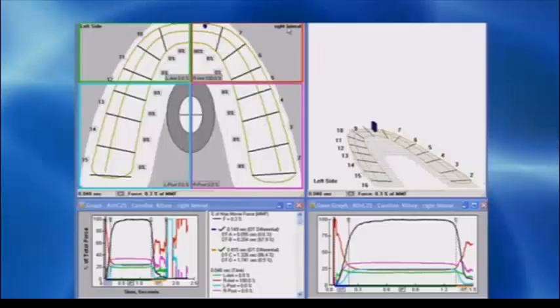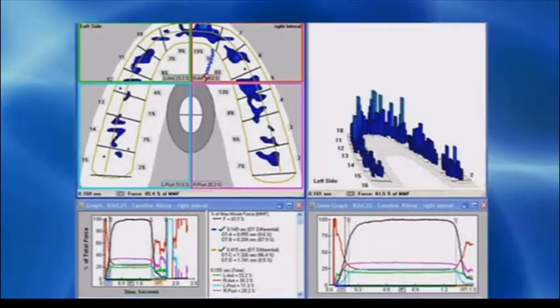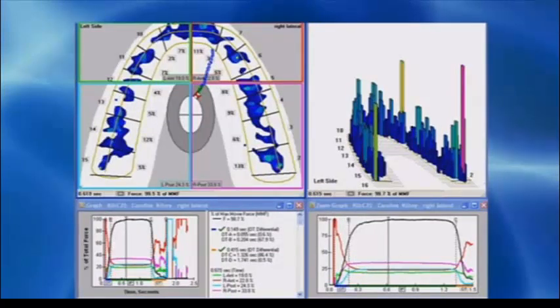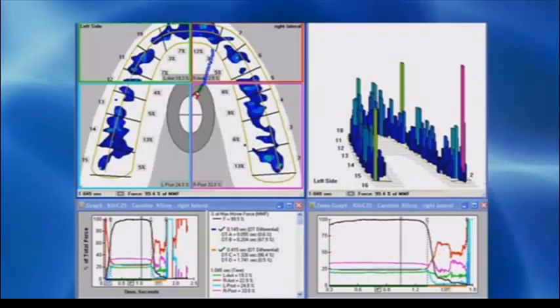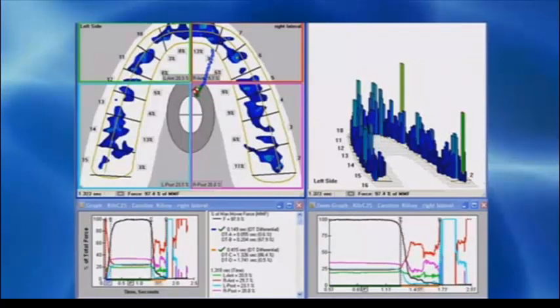So, Caroline, in looking at the data after a week, there's been the development of some anterior pressure. You can see that here, that your front teeth are becoming more forceful before the back teeth start to get into contact. So I'm going to need to relieve that. However, your center of force is still very stable. It hugs the midline, comes straight back to the middle of your occlusion, and that's a really good sign for positive closure and balance in your bite.